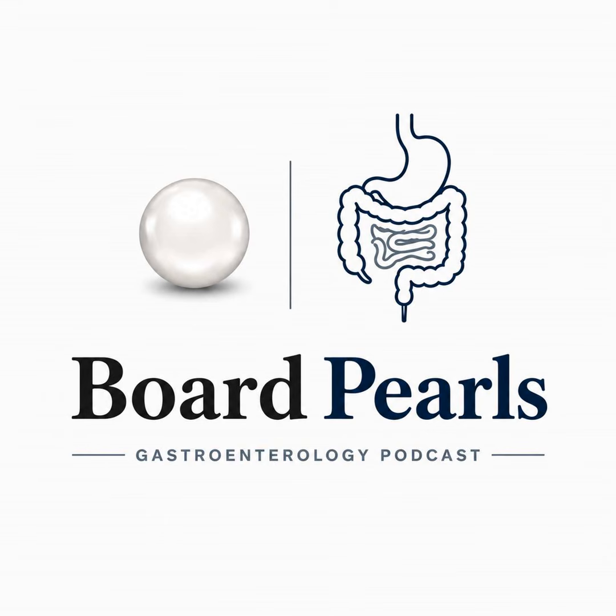A patient has a hilar mass, bilateral intrahepatic dilation, and is being worked up for liver transplant under the Mayo protocol. You have just internalized that EUS gets you the best tissue, so the reflex is to put a needle into that hilar lesion under EUS. Do not. In a transplant candidate, EUS fine needle aspiration of the primary hilar tumor is contraindicated.